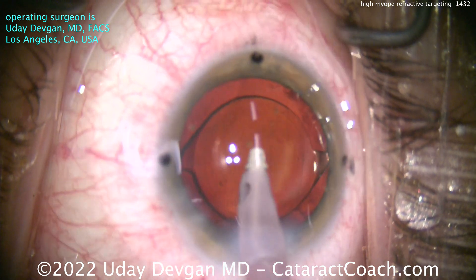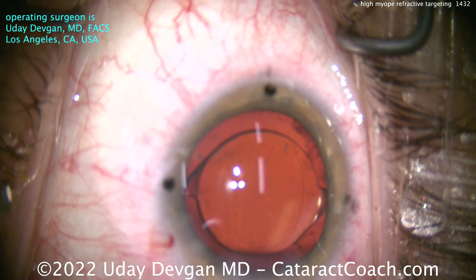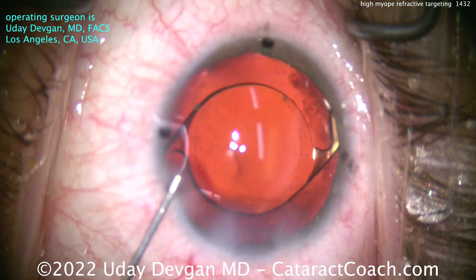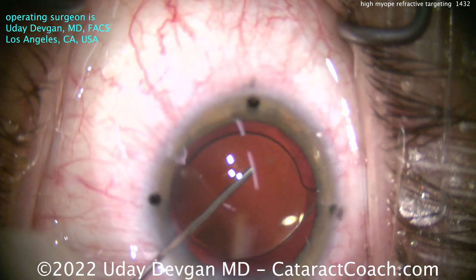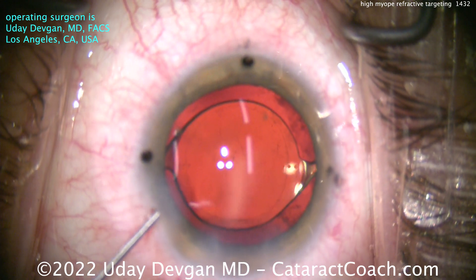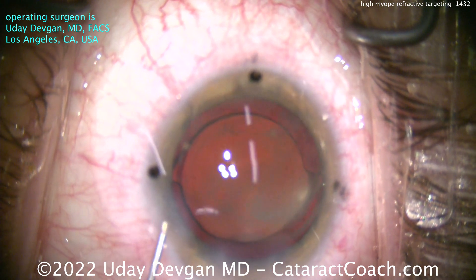The beauty here is the patient ended up just about what we predicted — about minus 1.25. She found that was good enough to do most of her normal activities, including computer work, stuff around the house, her favorite hobbies of cooking and baking — all without glasses. She certainly wears glasses to drive, especially at nighttime. But even in the daytime, going outside with a refractive error of minus 1.25 in the bright California sun means you actually see pretty well without any glasses. It was the right choice, and she was very happy with the outcome.